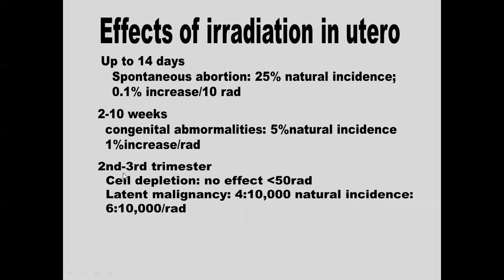And then second and third trimester, once again, greater than 50 rads of radiation. So the risks are there, but they're very small. Now, do you want to do one just for the heck of it? No. But if you're actually in the cath lab working and you become pregnant, just taking a step back and wearing lead, the chances are very low.